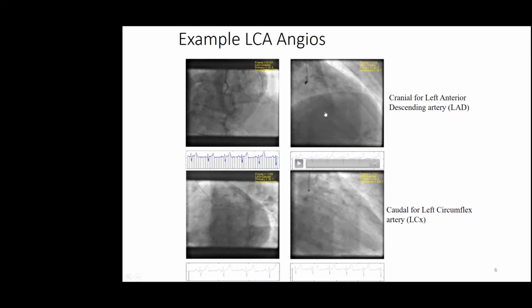So here, let's take a look at another view. Here is the catheter. So they are going to inject the contrast from this tip, and you will see how the contrast is filling the blood vessels. And you can imagine that it's very difficult to get a good three-dimensional understanding, which is what you really want, of these structures, which are, again, three-dimensionally very complex, from just these two-dimensional views.